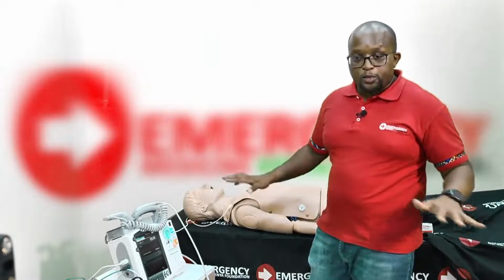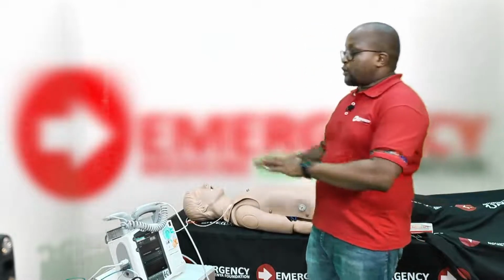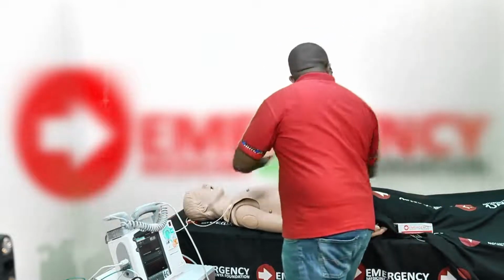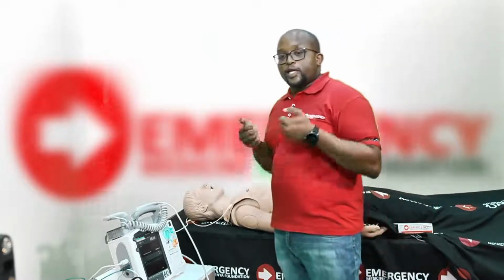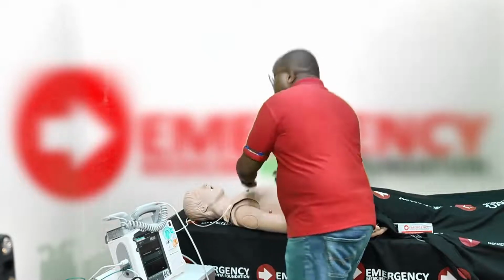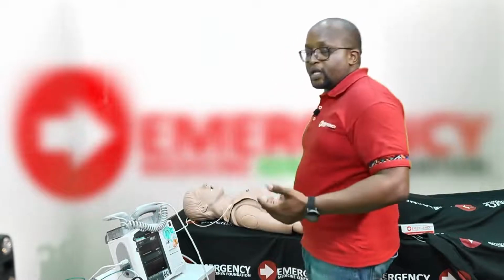So no one should be touching even the IV poles that are next to the patient. No one should be touching those poles. Everyone should be clear. So a good shout of clear and checking to make sure no one is touching the patient before you shock the patient. This is the responsibility of the person who's going to do the defibrillation, to quickly shout clear, and they themselves also need to make sure they're not touching the patient, because the patient's hand could be just next to them, and then they will end up being shocked.